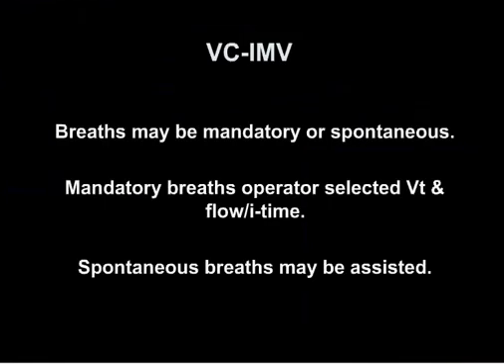Volume control IMV. Breaths may be mandatory or spontaneous. Mandatory breaths are operator selected tidal volume and flow/I time. And spontaneous breaths may be assisted.